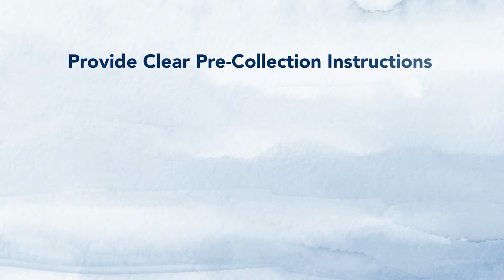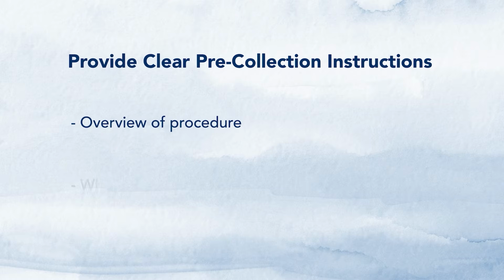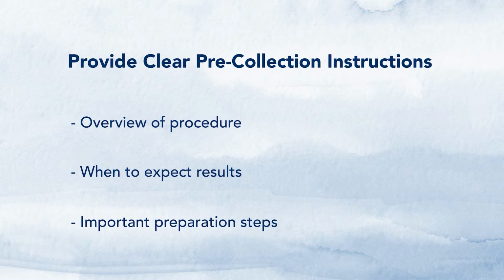Before the appointment, provide clear pre-collection instructions to the parent or guardian. Instructions should include an overview of the procedure, when to expect results, and important preparation steps, such as ensuring the child is well hydrated, not sick, and has avoided using creams or lotions.